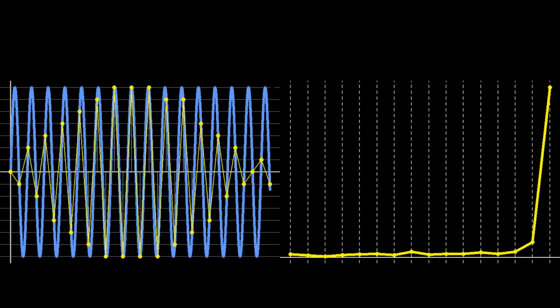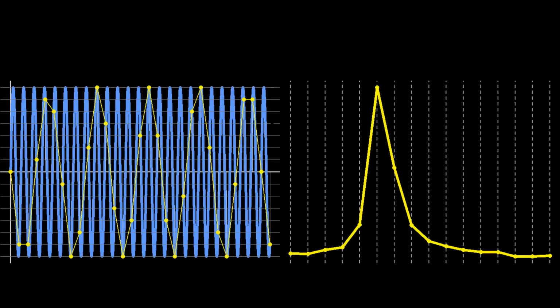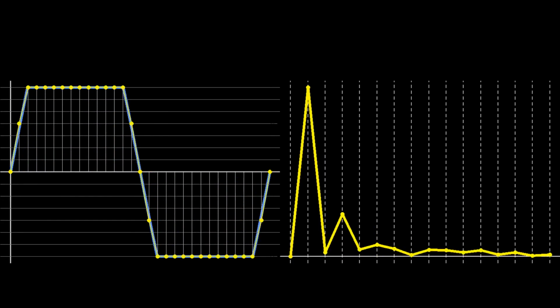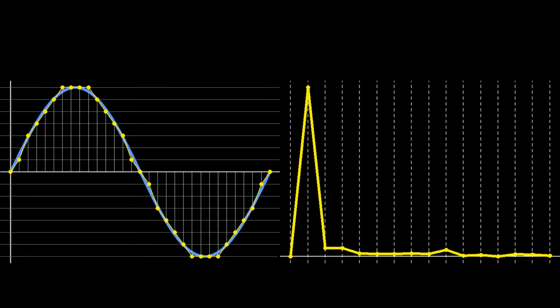Note as well that having a super high bit depth doesn't help you much if you don't properly amplify your signal before it reaches the ADC. If your signal is too weak, then you're not taking advantage of all the bits available to you. And if too high, the signal can only be cast into the highest and lowest bins, resulting in clipping and introduction of unwanted harmonics in your Fourier signal.